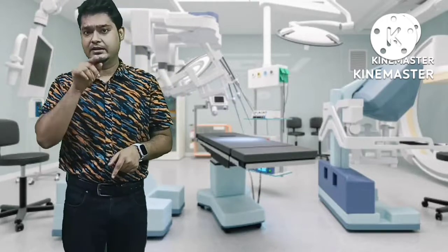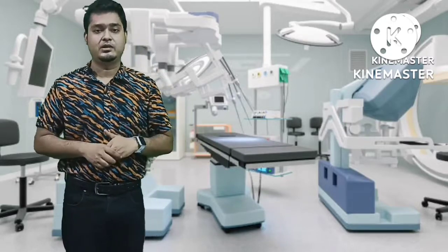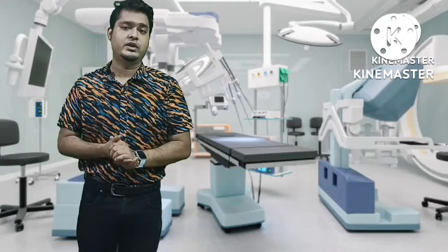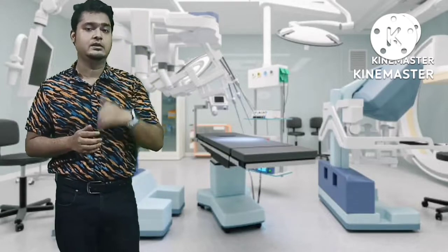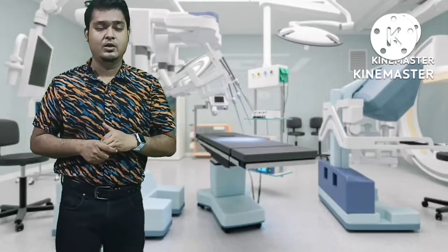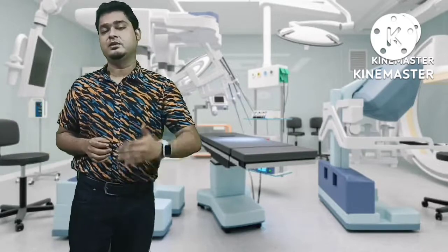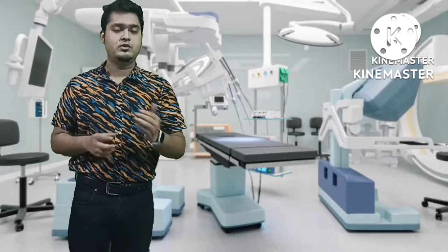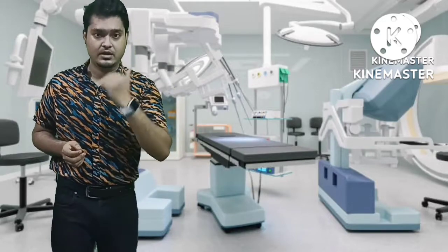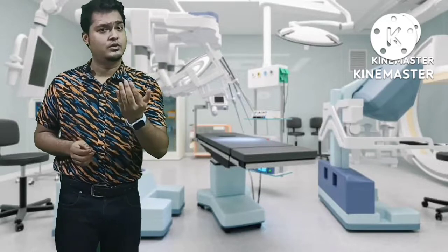Also, you have to note the heart rate of the patient. If the heart rate is higher than 60 to 65 beats per minute, then you have to give the patient beta blockers to reduce the heart rate, because it is very important to maintain the heart rate below 60 for good images while performing the coronary angiography. So we will prepare the patient in this way. This is basically the primary preparation of the patient. Now we are going to discuss the secondary preparation of the patient. On the day of the examination, when the patient comes to us after taking the primary preparation, what will we do?